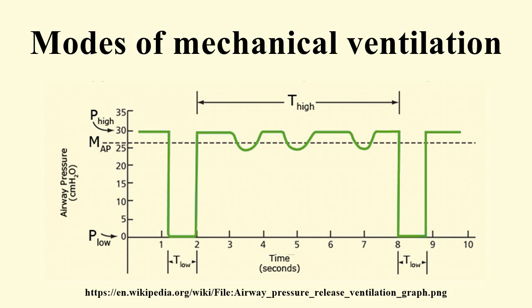Airway pressure release ventilation. Airway pressure release ventilation is a time-cycled alternation between two levels of positive airway pressure, with the main time on the high level and a brief expiratory release to facilitate ventilation. Airway pressure release ventilation is usually utilized as a type of inverse ratio ventilation. The exhalation time is shortened to usually less than 1 second to maintain alveoli inflation. In the basic sense, this is a continuous pressure with a brief release.